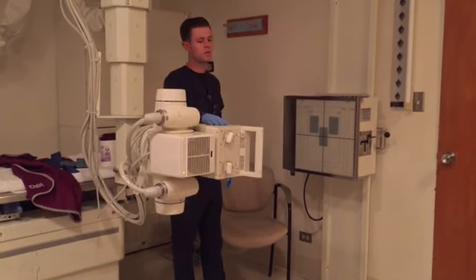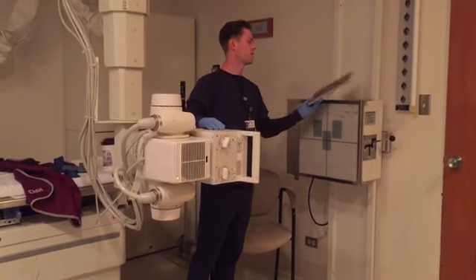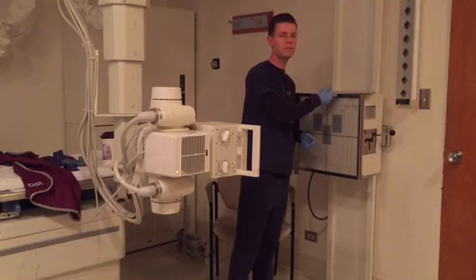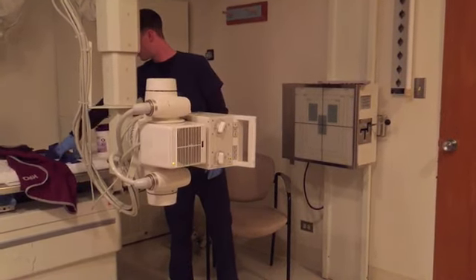We're going to be doing 8 total images, so I'm going to have them seated. It's going to take a little while. I'm going to be using an 8x10 cassette. You want to use the smallest cassette possible. I've got my shield here ready to go. Thyroid shield.